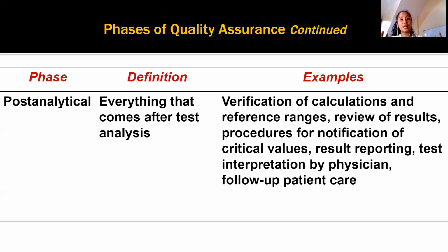And finally, the post-analytical phase, after the actual testing process. So you verify whether the calculations are correct, right? Class, even now, you make mistakes in the units. Then you say, ma'am, there's no unit. So class, you have to be careful because wrong units will result in wrong results, right? Wrong calculation, wrong conversion, class. I only asked you to convert mL to microliter, and you're still confused, right? That's only a simple conversion. So, class, right?